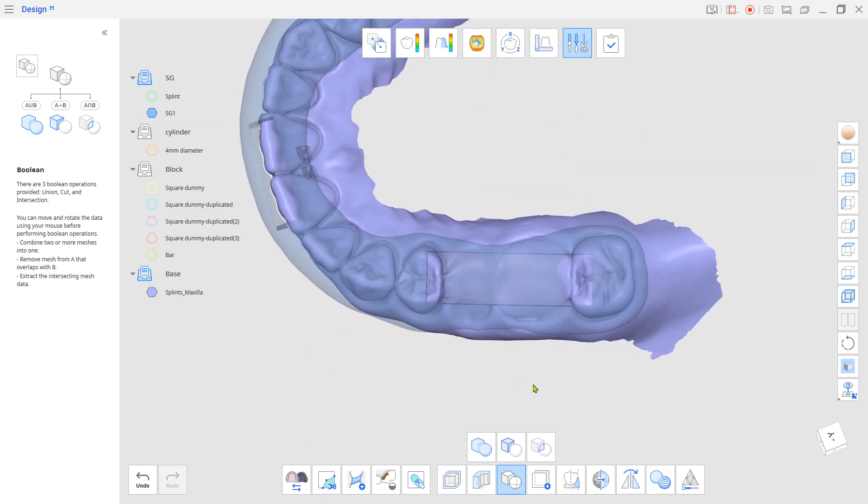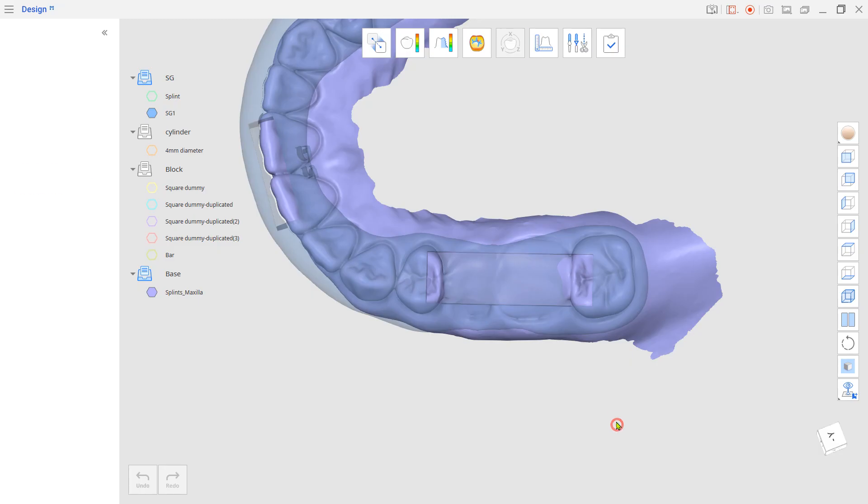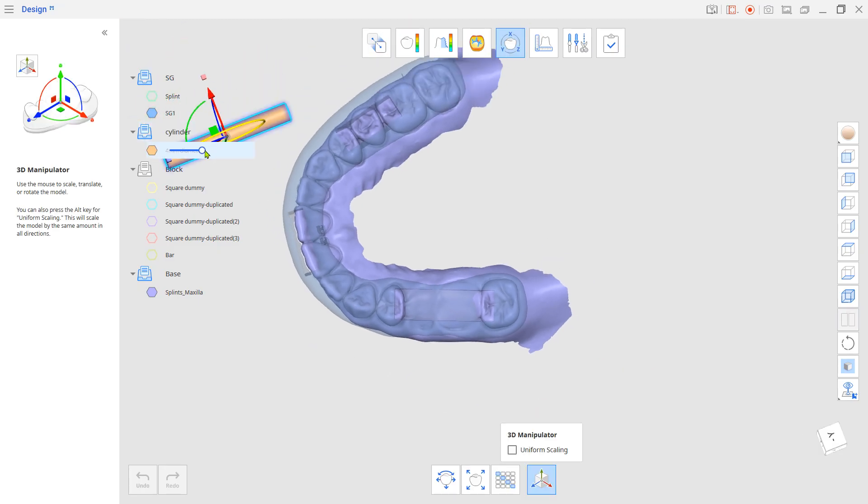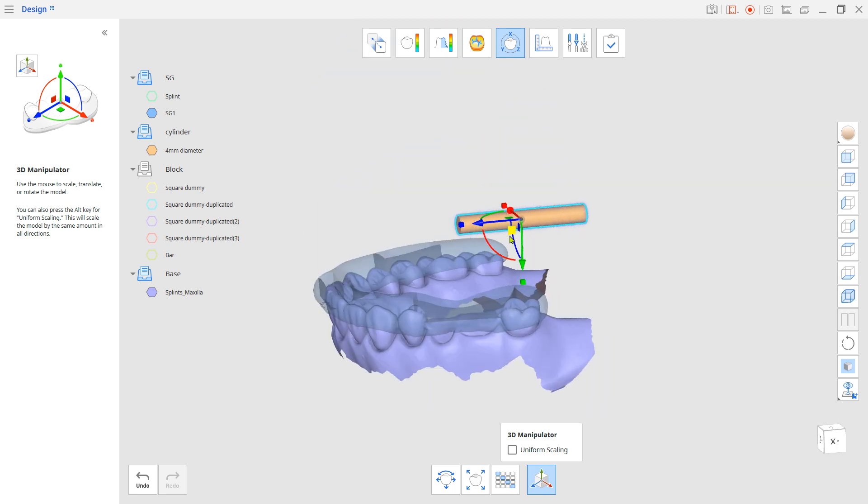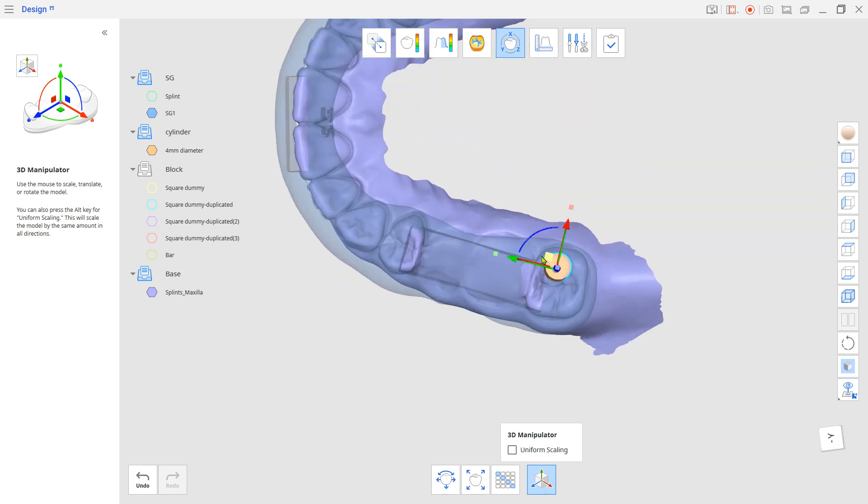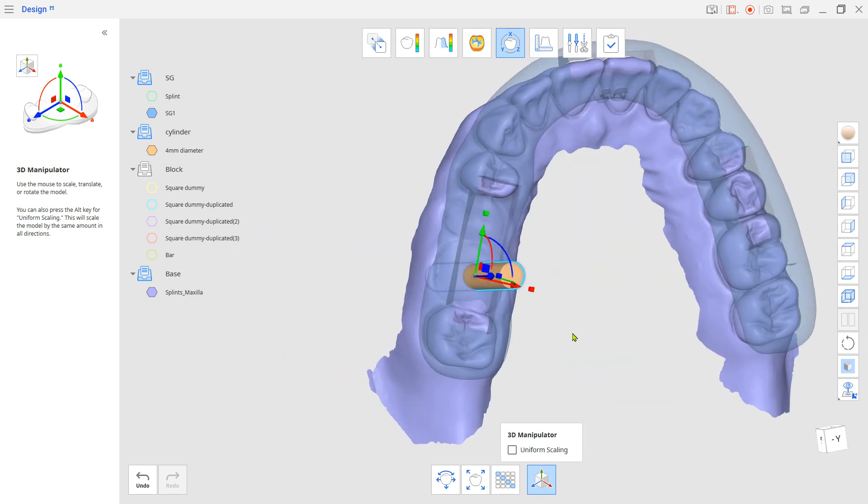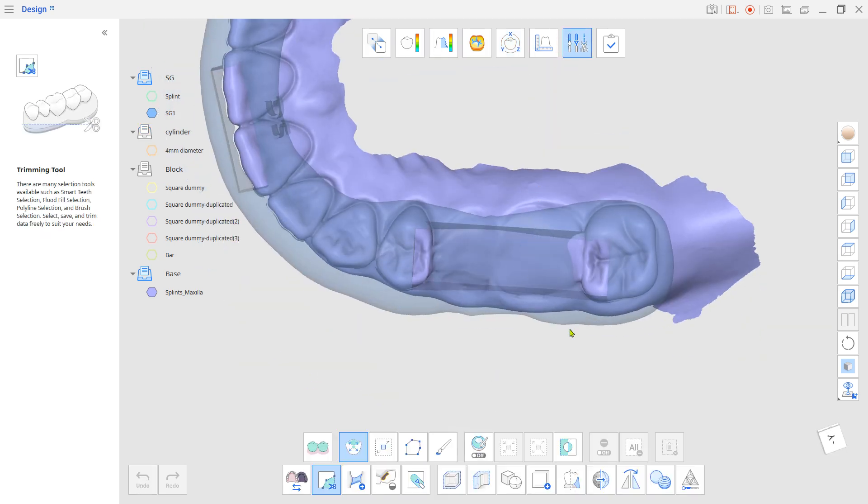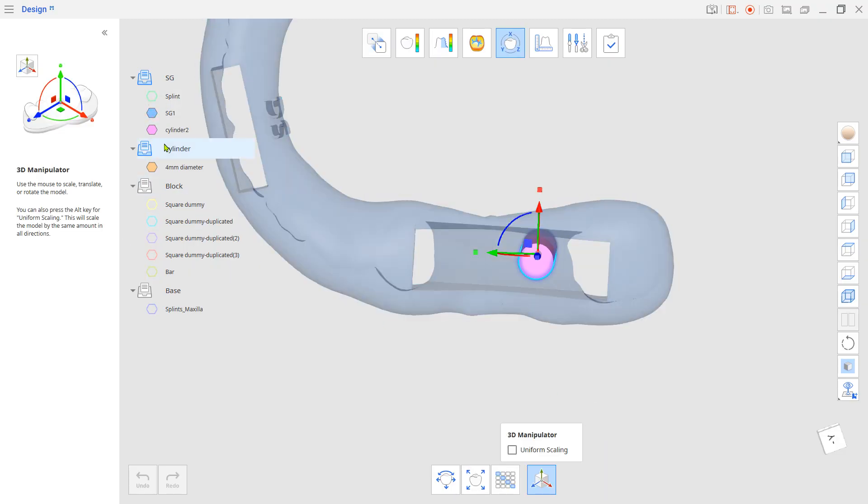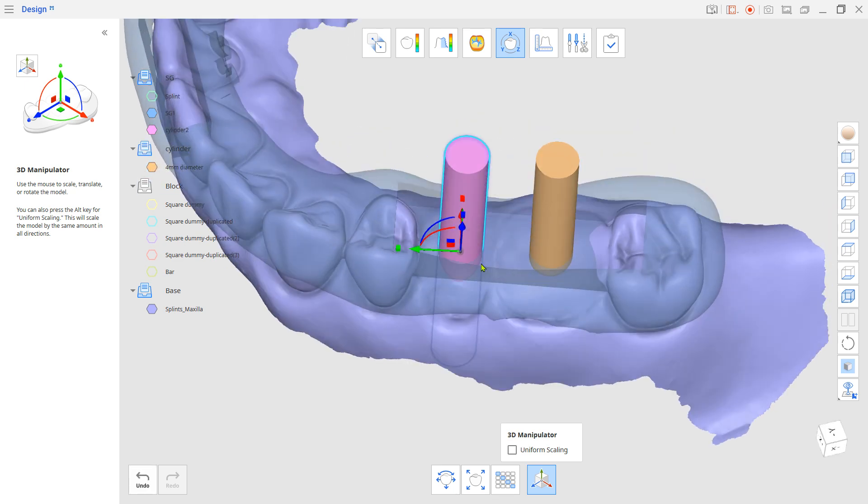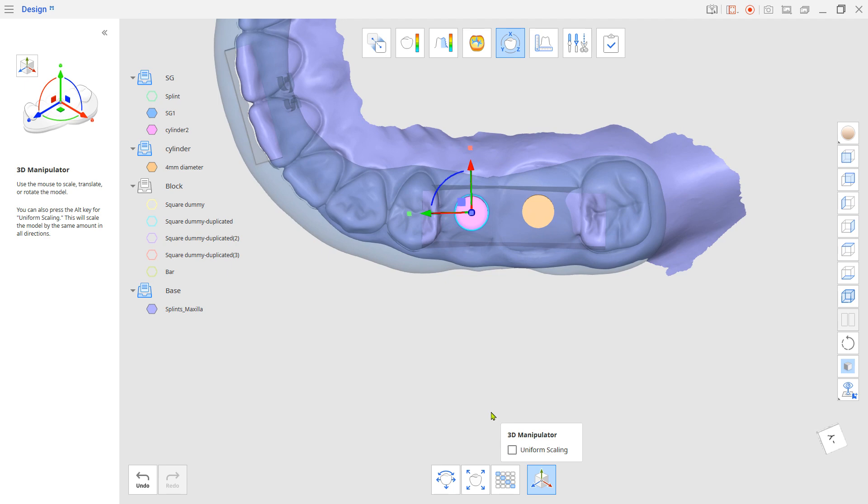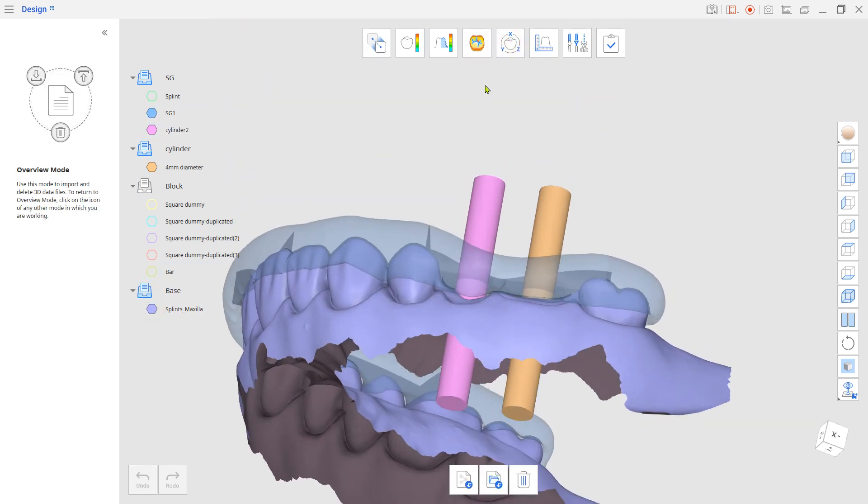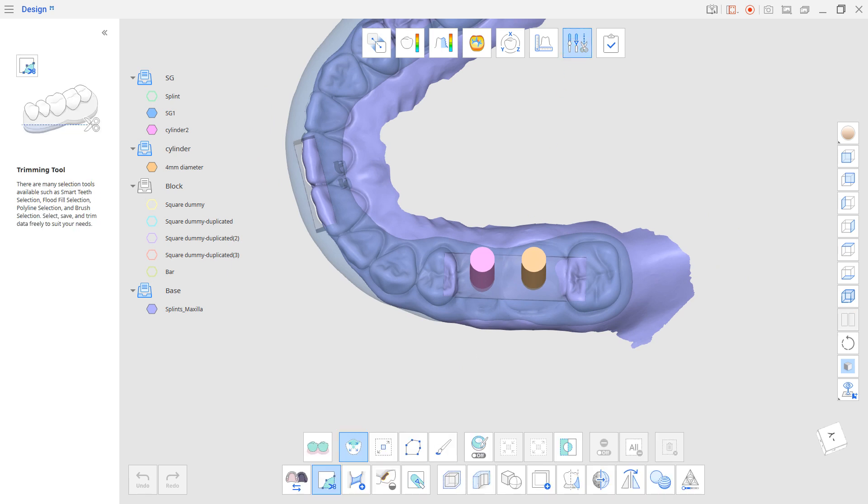Now go to Transformation Mode and locate the cylinder to make the drilling holes. Once you set the position, go back to Edit Mode and cut the guide tray with those cylinders.